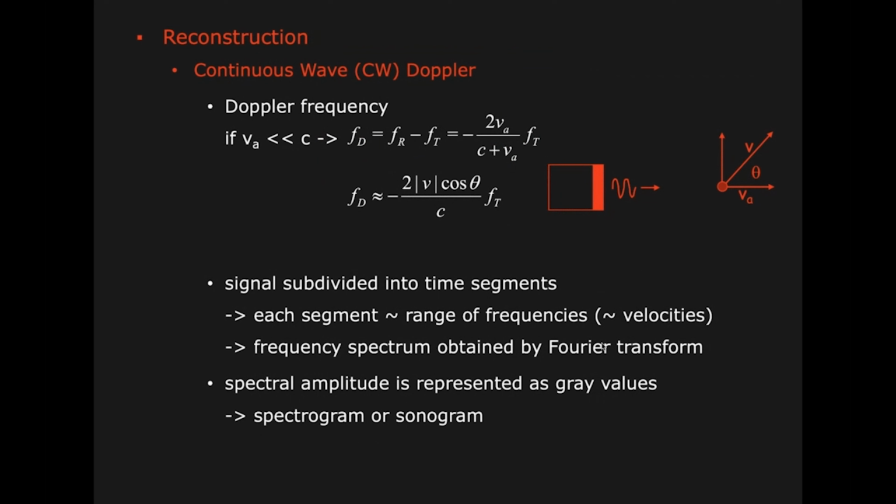Keep also in mind that we have nonlinear propagation, which means that the frequency can double. So we have a doubling of the frequency. The other thing is that we have a frequency-dependent attenuation, as I told you before. So if we send out a broad spectrum, the average frequency apparently seems to change because high frequencies are attenuated more than low frequencies. So if we send out a broad spectrum and we receive that same spectrum, then because of the attenuation, the average frequency of that spectrum will have changed.